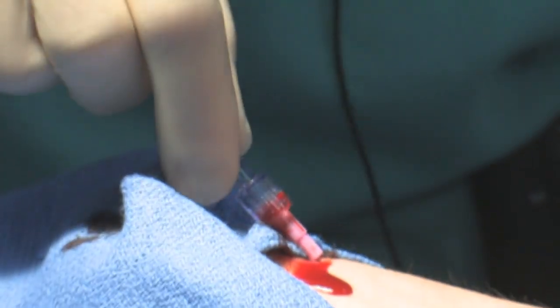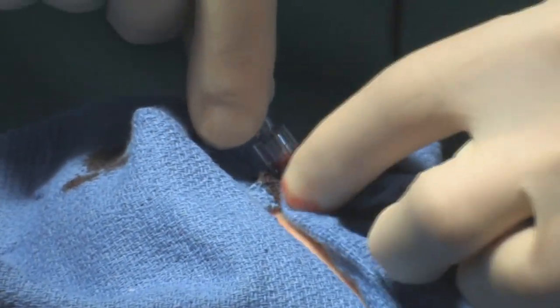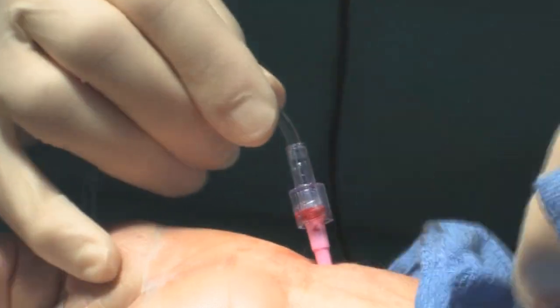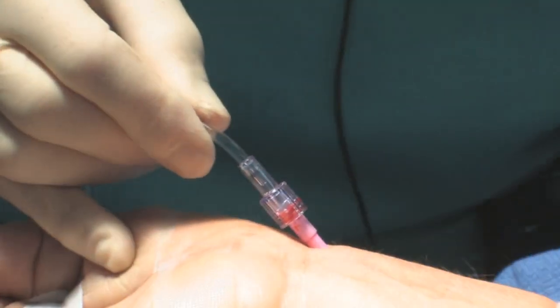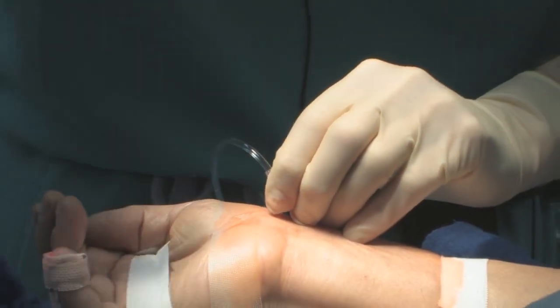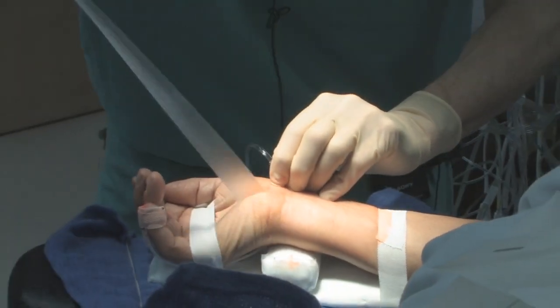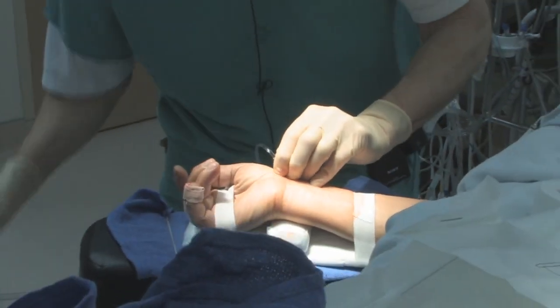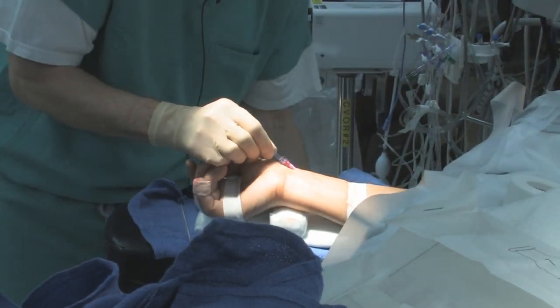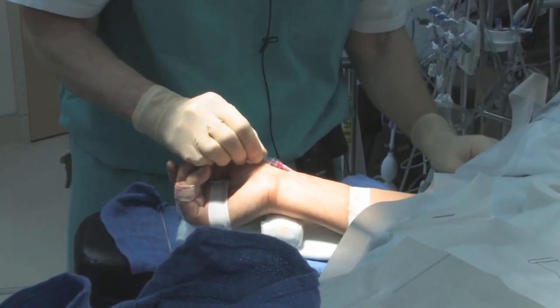You can bend it up a little — it's flexible. All these towels are clean. You can't wipe with the part that has blood underneath it, so turn it around — notice there's no blood anywhere. You can't tape with the tubing pointing down, so you've got to switch hands without five people helping you. Toss the tape down. I like to go around the thumb, so I put it around the thumb and then this piece hangs like a fishing float — make sure it's secured, or ask someone to hold it.